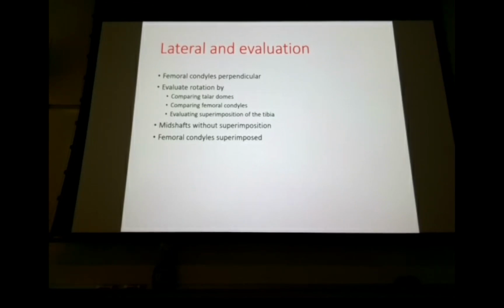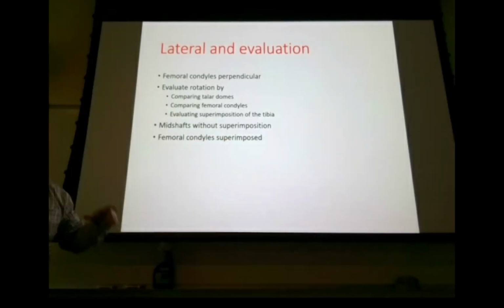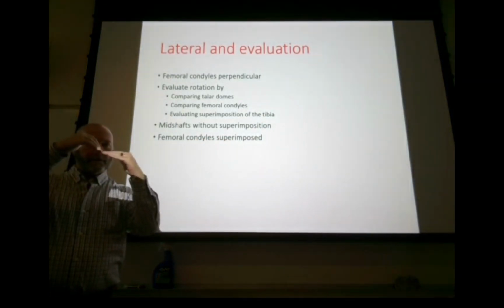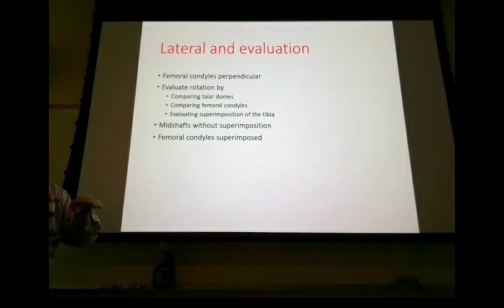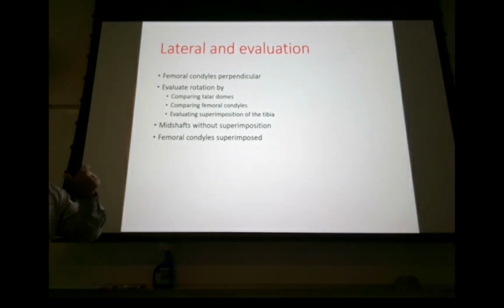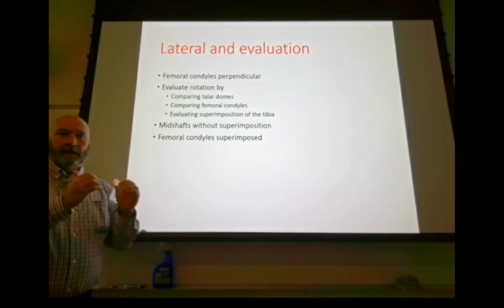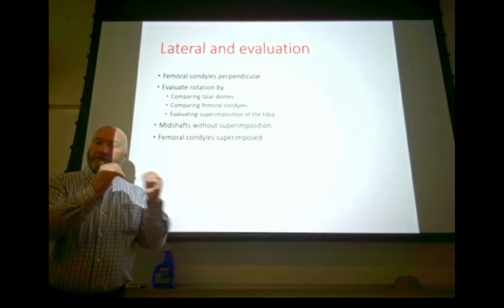So how we're going to evaluate our ankle and our tib fib is to look at the talar domes. Okay, so your talus kind of looks a little like a car. It's got a little hood out front and then it's got a cab, right? But that cab has a little bit of an indentation in the center of it. So what we're going to look for is that superimposition. On your leg, they're not going to be perfectly superimposed. On your ankle, they should be.